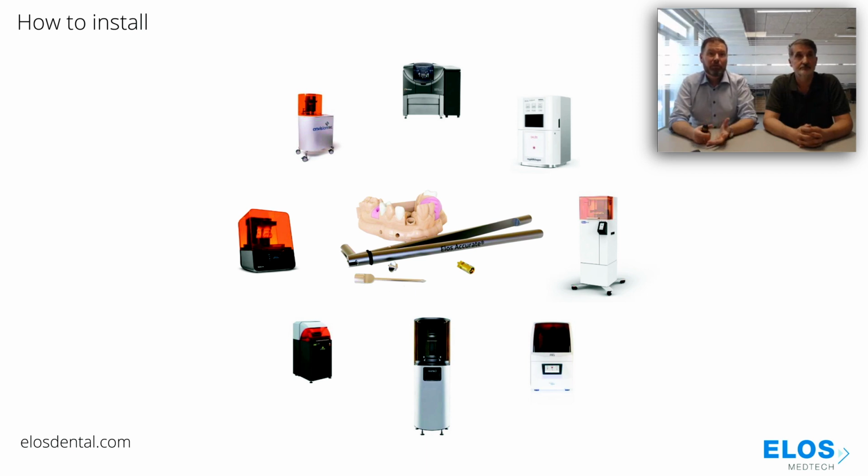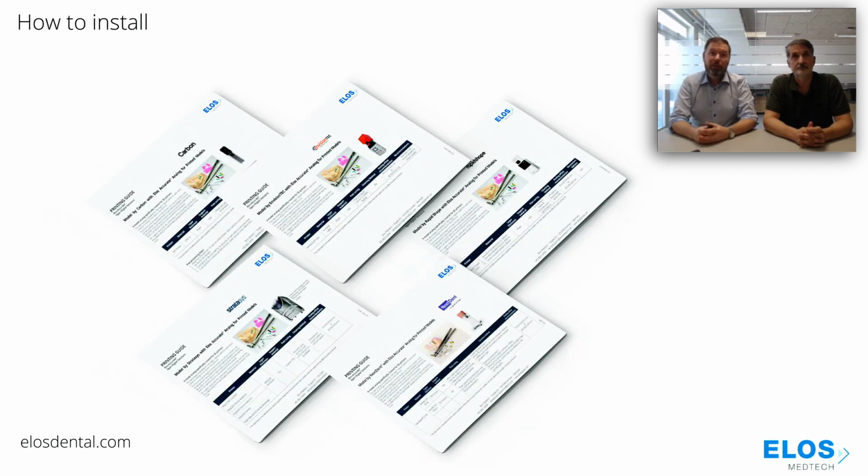time, where we tried to do it with new printers coming into the market, and the setup is the same. So we send parts to the manufacturer, they do a test run, they figure out what their best settings are. And then we have these printing guides, which are also available on elosdental.com. Basically, it gives an overview of what the curing method is, what the recommended cleaning methods are, what kind of materials they recommend, and the layer thickness. And then, together with the manufacturer, we come up with recommended analog to model offsets, which I know you have a lot on in our tips and tricks.